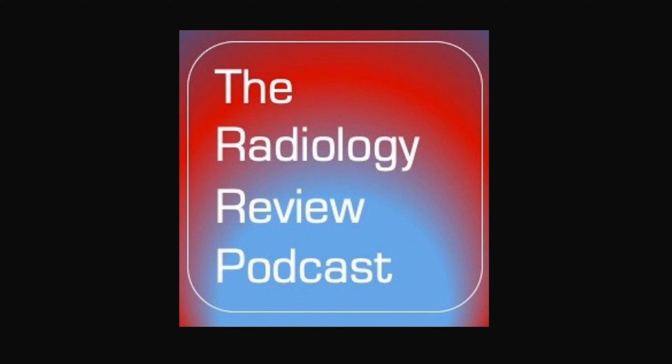You also know that these types of questions can be tricky, so on this episode I will present in question and answer format various tips and tricks to help you correctly identify nuclear medicine scans that are commonly tested on these types of questions.